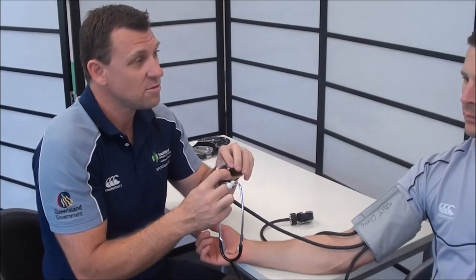We should also ask the client if they've ever had blood pressure taken before. Have you ever had your blood pressure measured? Yes. Have you ever been told that it's abnormal? No. Okay.